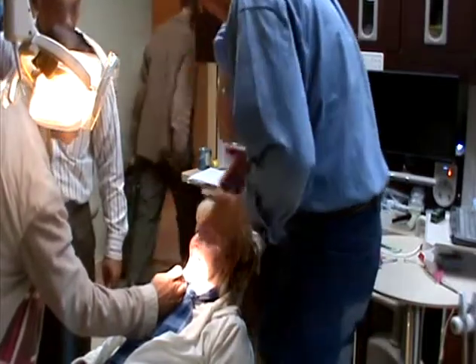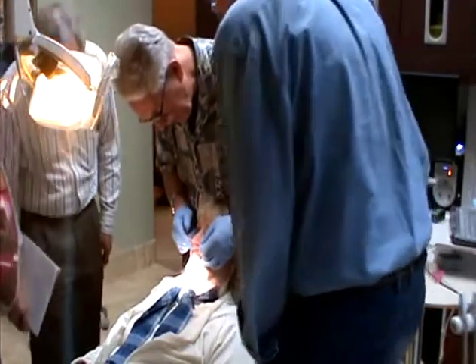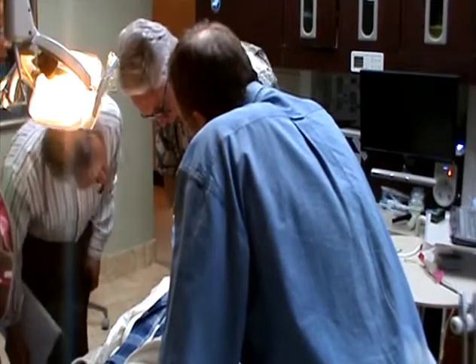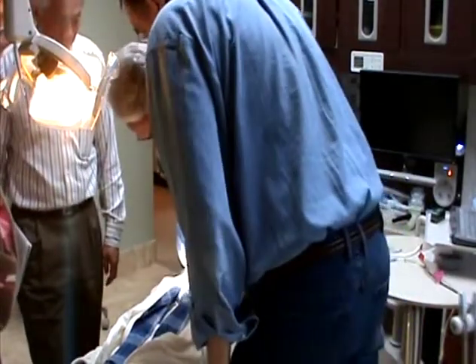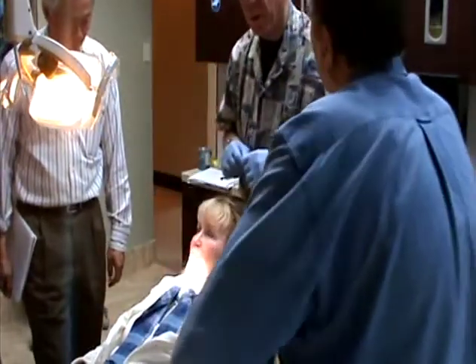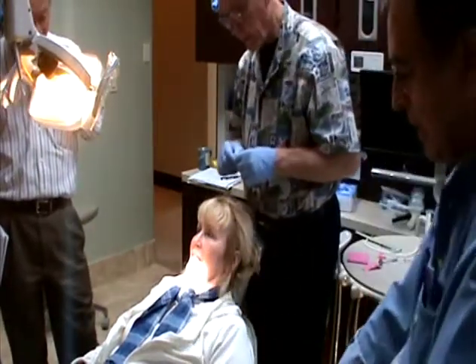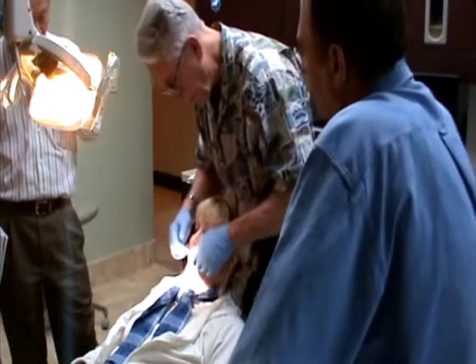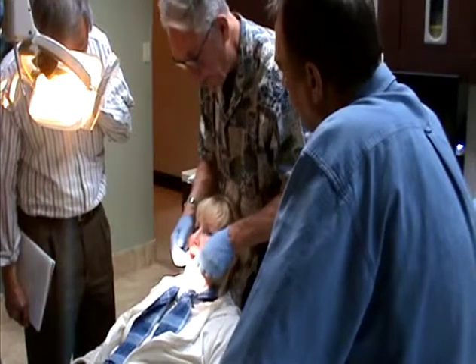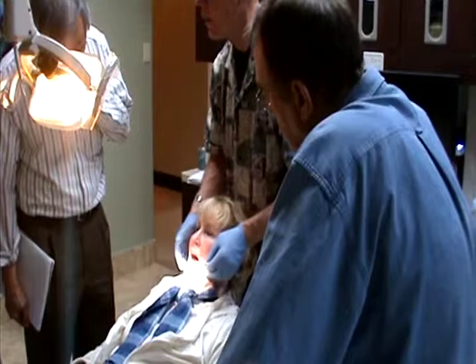He's saying the mandible's shifted to her left just a little bit. It should be over to her right more. It should be shifted this way a little bit. That will put the midline off farther than it is right now. If the midline's off about 1/4 millimeter, that'll put her off maybe 1/2 or 3/4 of a millimeter. But regardless, the jaw's maybe shifted to the left. If these things weren't indented and they were flat, so they can slide, then her jaw will go where it wants to go.